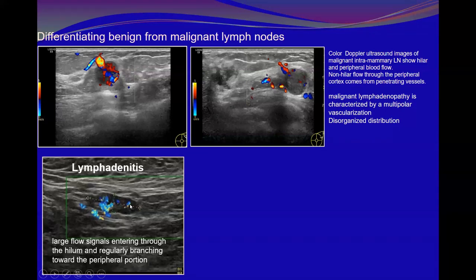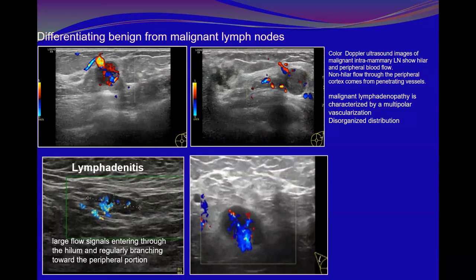In this case of lymphadenitis, it was proven to be just a reactive lymph node. There was no peripheral vascularity. The vessels from the hilum extend toward the periphery because of hyperemia associated with inflammation. And this one, can we see here? There is hyperemia, there is increased vascularity, okay? What do you think about this case? Again, it is mainly hilar vascularity, increased vascularity.